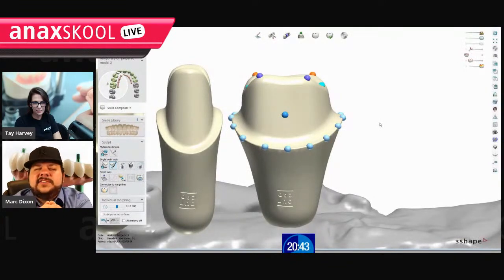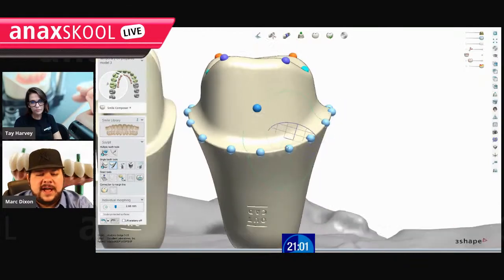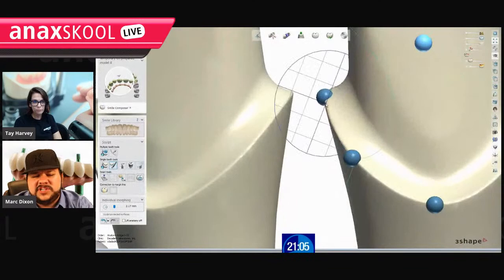because you could put as many. I believe these are the occlusal pit annotation points, because there's only so many cusp tips. Yeah, the software doesn't allow you to put all the points you want on the cusp tips, but with the pits, you could put as many, and I think that's what he used here. Now we can go in and actually move every little bit. Oh, it just makes it so much easier.